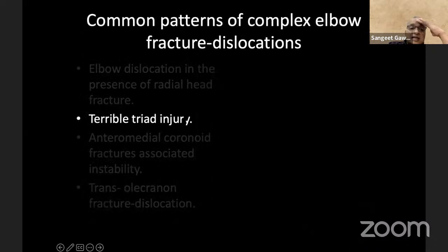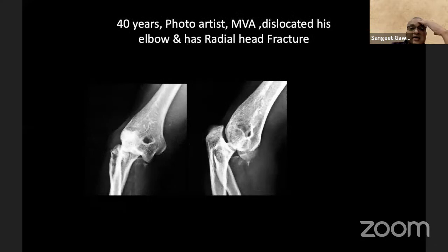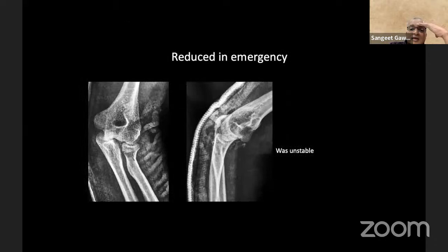The second entity where you get fracture dislocation is a terrible triad injury. Sir has covered most of it, but I have two cases which are different, and that is why I am presenting them. So here is the one, this photo artist, 40 years old. So he has a coronoid process, a comminuted radial head, okay, and he was reduced in the emergency, but it was unstable. You can see here the ulna and the trochlea are not reduced. It is already laterally subluxated.